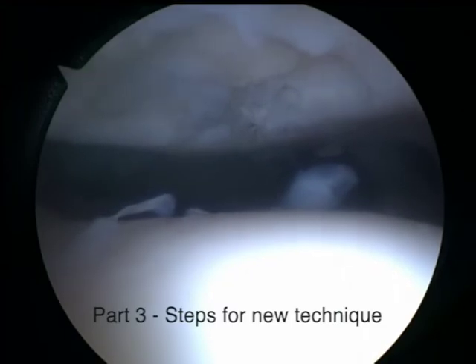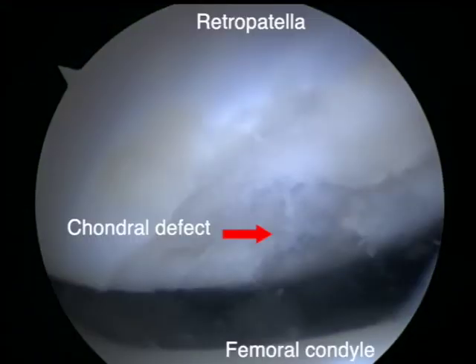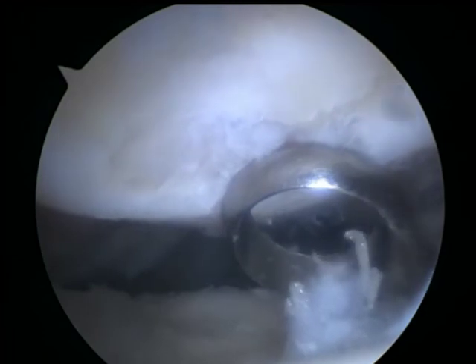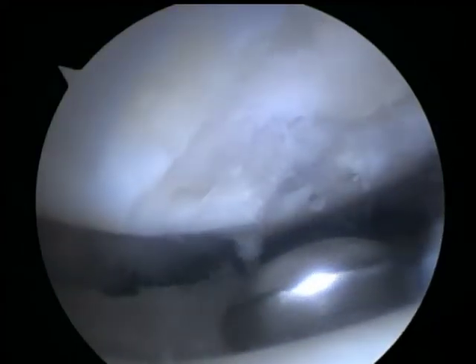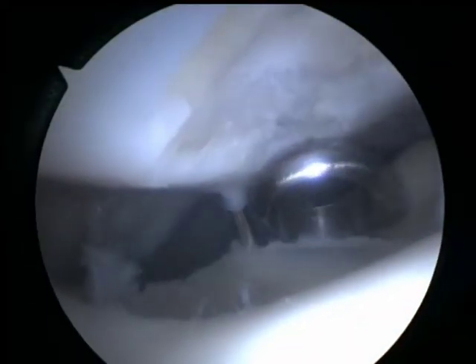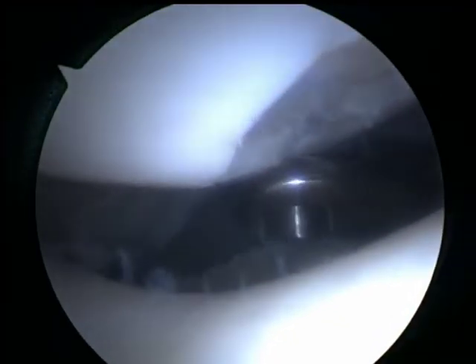The third part of this video will be describing the steps for inserting the K wires. Using a blunt instrument such as a ring curette in this example, a counter pressure is applied from the deep side of the patella against the drilling of the K wire. In our case, this first K wire has exited the deep side of the patella away from the site of the defect, which is less optimal than exiting directly from the site of the defect.